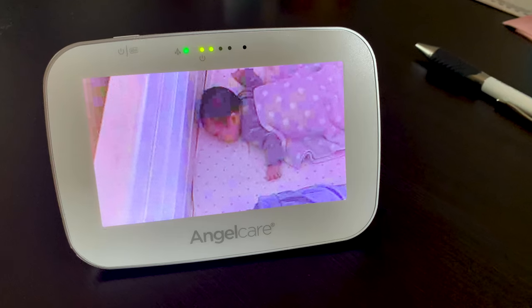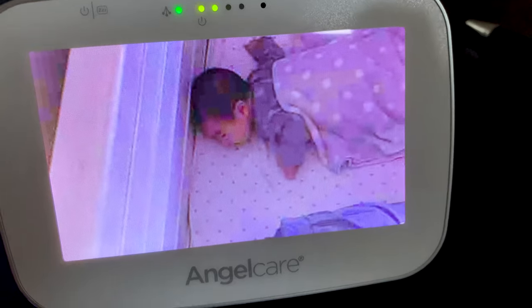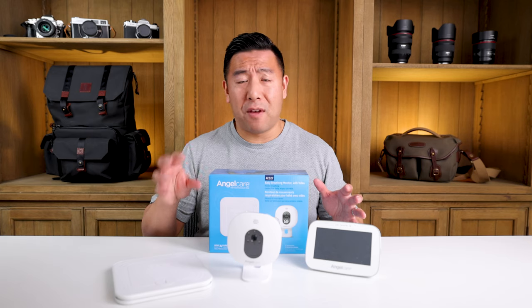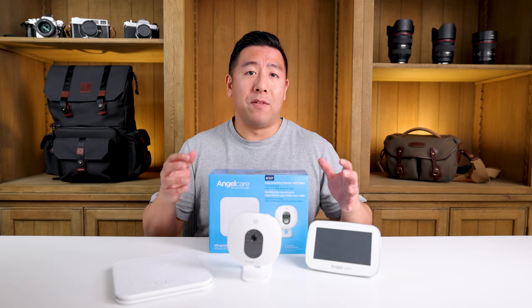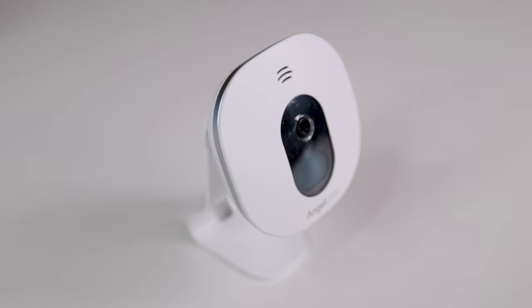Let's talk about the video quality — it sucks. It's probably the worst video quality camera I have ever seen, and if there's low light or a dim room, it's even worse. I would highly not recommend this for the video capabilities.